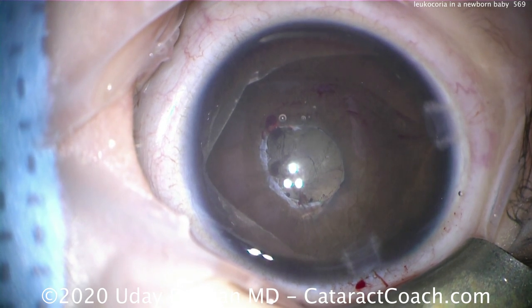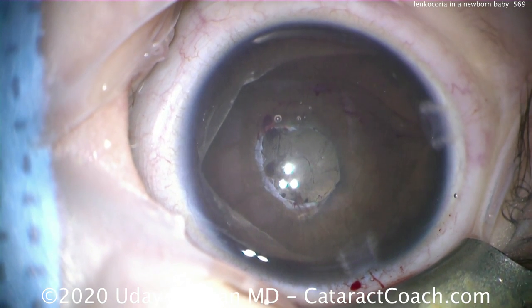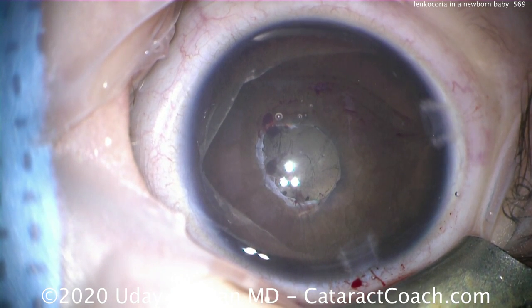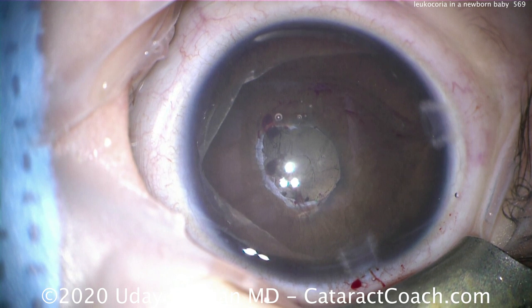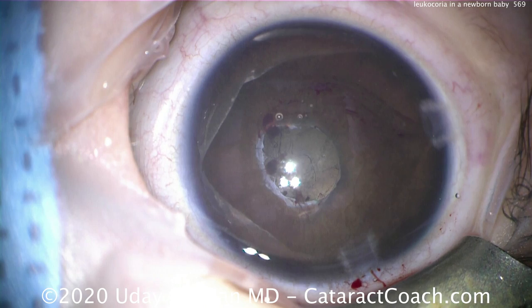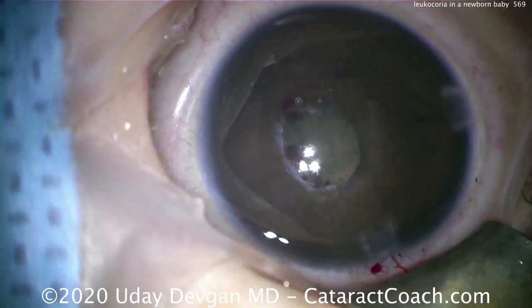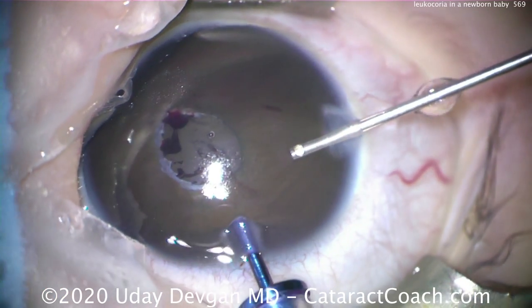Here it is at the end of the case, and you can see we've achieved a good pupil. You don't want to just pull on a membrane like this, because if you pull on it you may disinsert the iris — so using micro scissors was a better option. Now the pupil is not going to be 100% normal, but this is now at least a good functioning size.